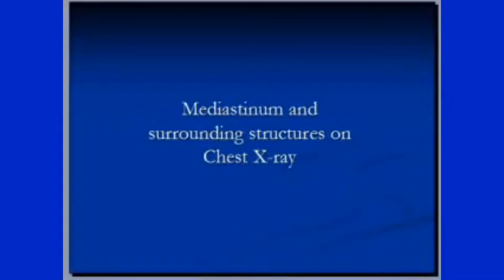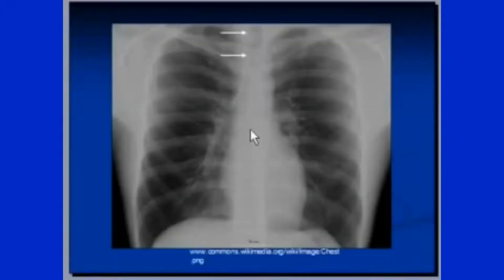In this video we will be learning about mediastinal structures as they are visible on a chest X-ray. In a normal chest X-ray, the trachea should be central to start with.